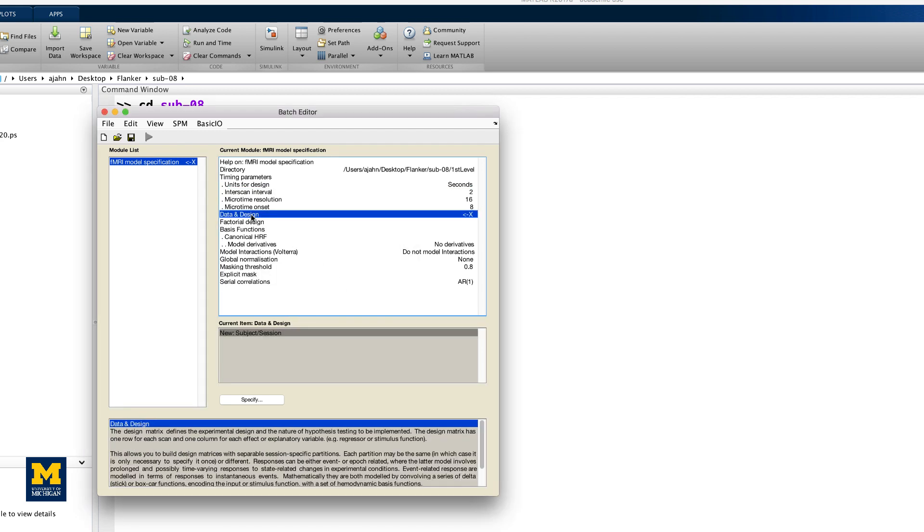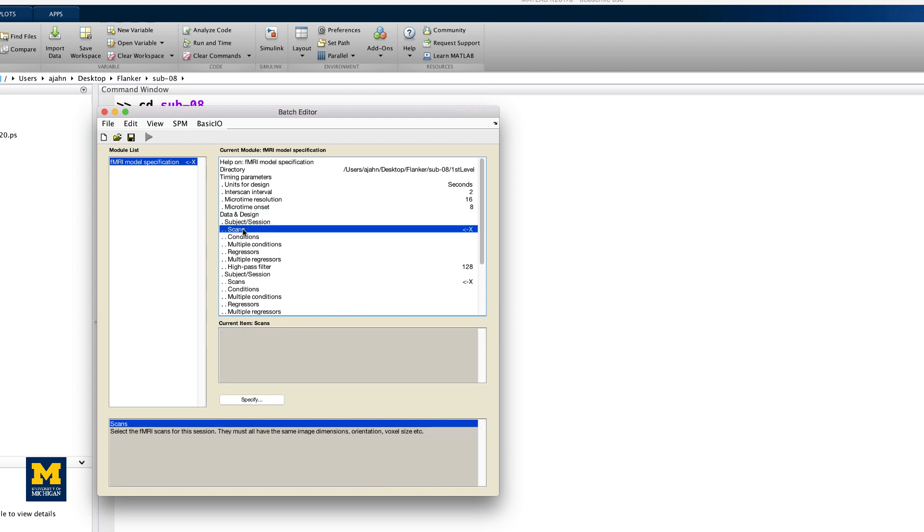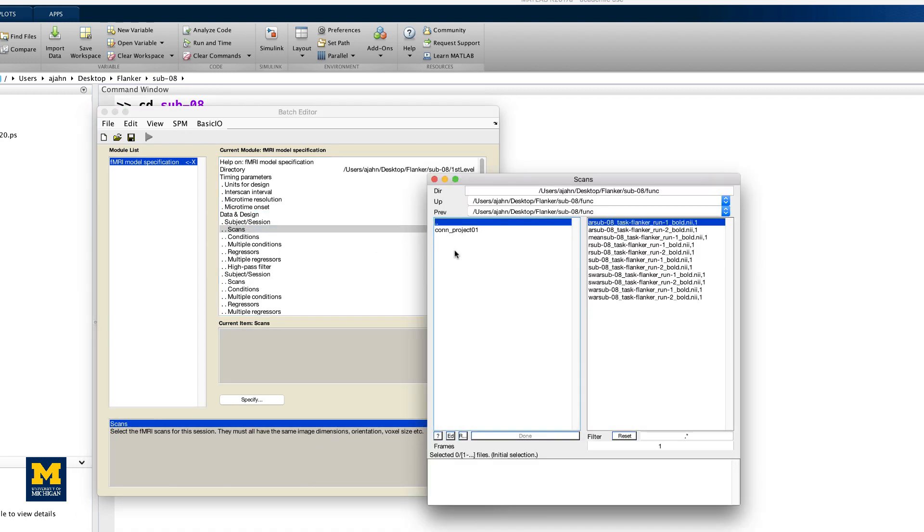Then, click on Data & Design and click twice on New Subject or Session to create two new sessions. For the scans of the first session, go to the FUNC directory and use the Filter and Frames fields to select all 146 volumes of the warped functional data.